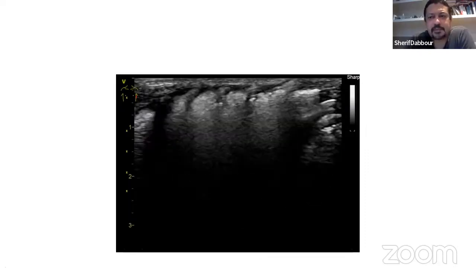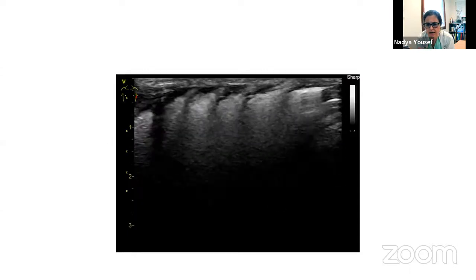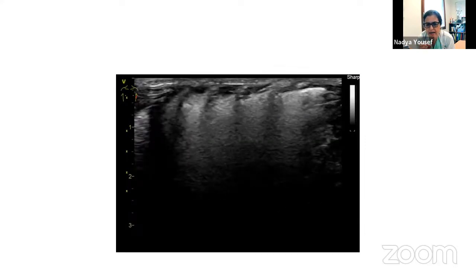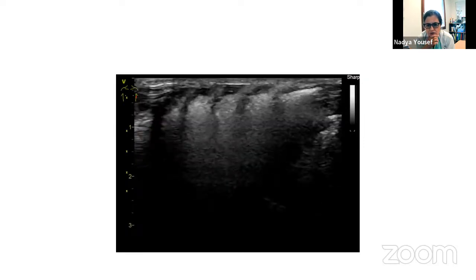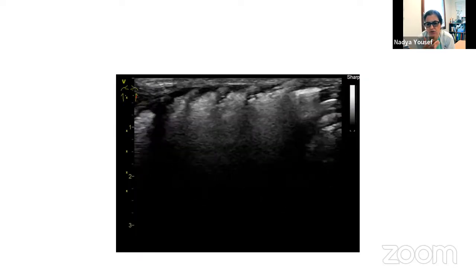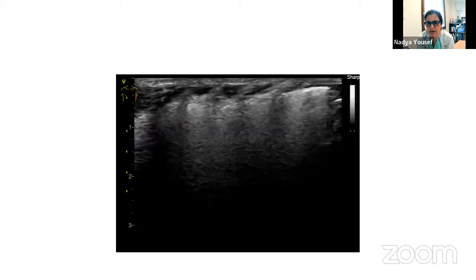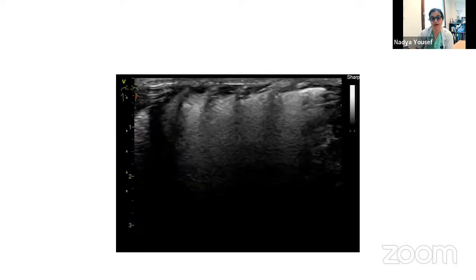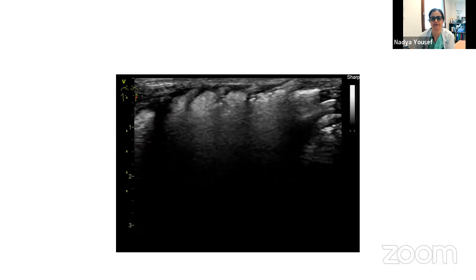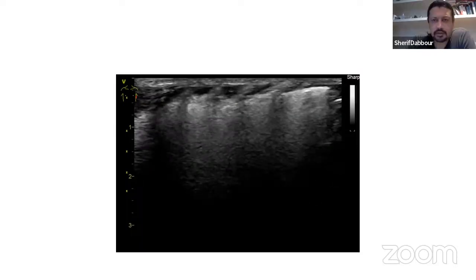These are micro consolidations with a scan that is not completely vertical, or at least perpendicular, which means that we're seeing a more rounded effect of the pleura instead of a line. And then we will see more of these tiny little micro consolidations. I don't think so. I think it's a constructed image because of the way the scan is being done. Once you scan more perpendicularly, you will see them a bit differently. But maybe there are some and I can't see it. I see there's one over here that keeps jumping in and out on the second intercostal space from the left, but it's difficult to say. I think it's the scan.